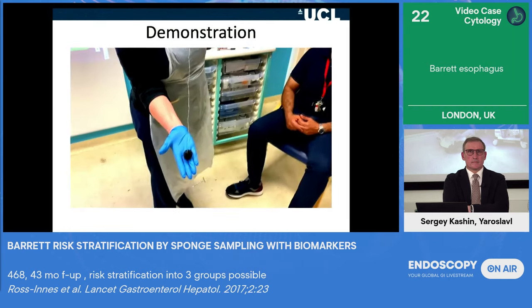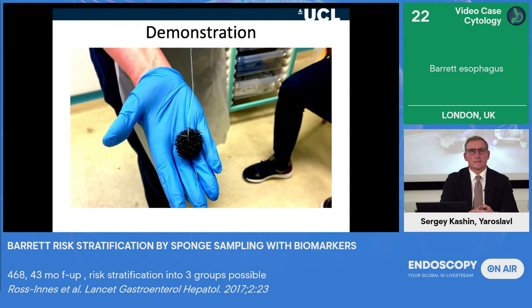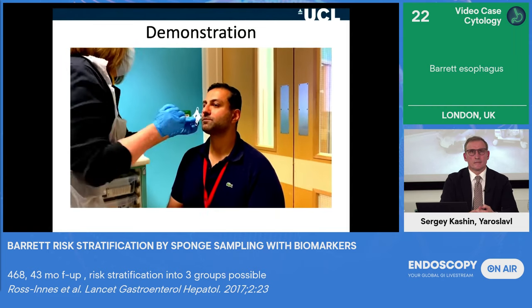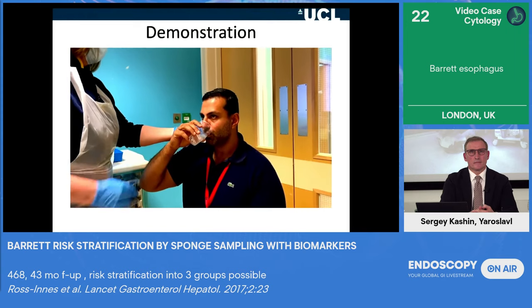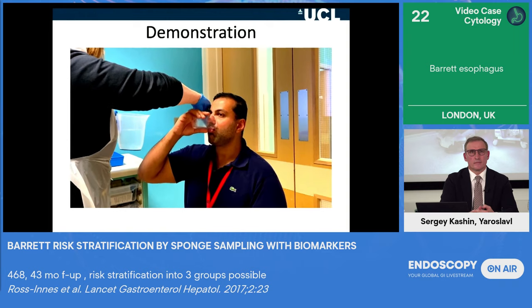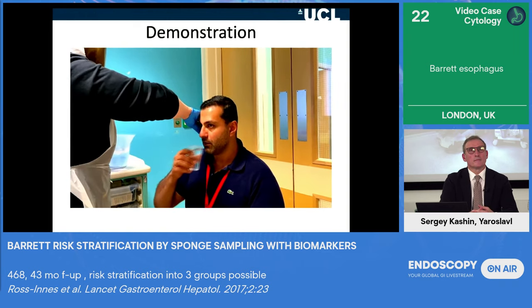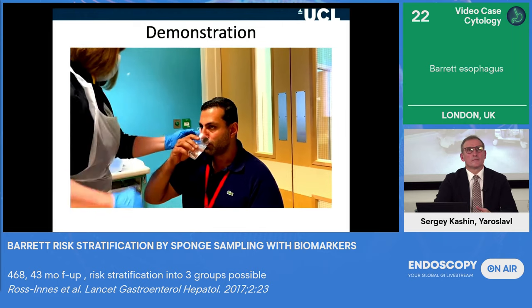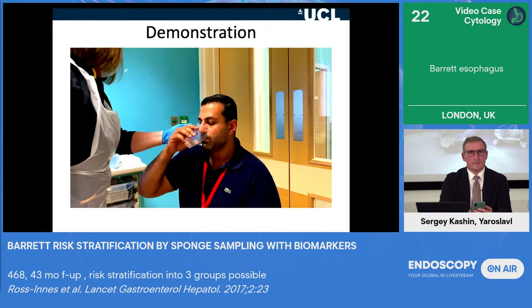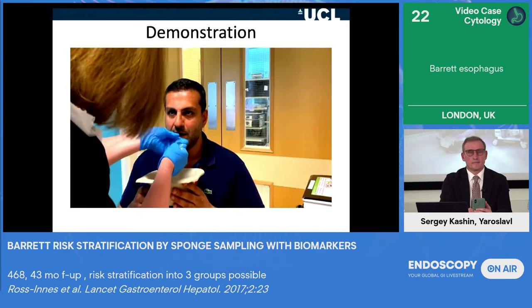This is what the sponge looks like. This is Sally, one of our nurses. This is what it looks like when you yank it out of the esophagus. And this will get a representative sample of cells. So the patient in question here will swallow the capsule and vigorously drink, you know, 4 to 5 glasses of warm water, which is really important because this helps the gelatin to dissolve in the stomach. We then wait for a 7-minute period, during which time we're absolutely sure that the gelatin has dissolved.